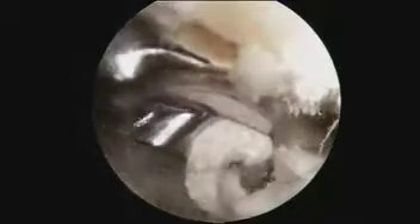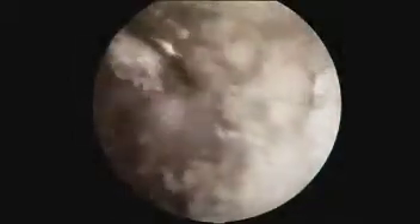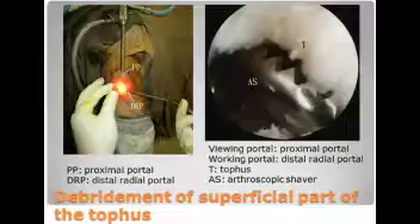With the proximal portal as the viewing portal and the distal radial portal as the working portal, the part of the tophus deep to the endoscopic working space is debrided with an arthroscopic shaver and arthroscopic punch forceps.